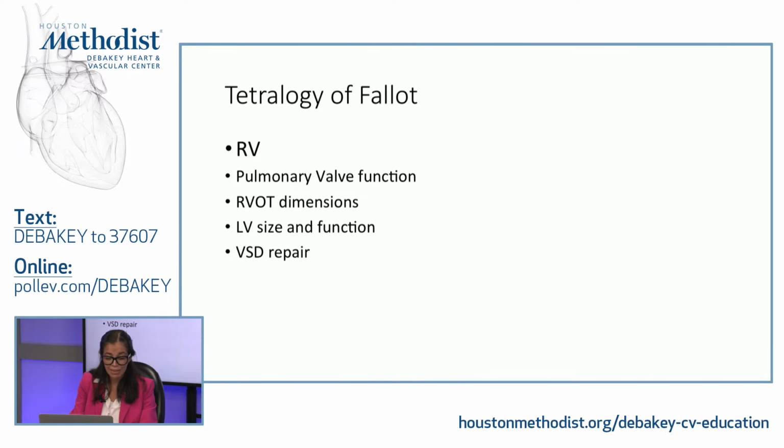And lastly, we need to assess for everything that was done. So we need to look at the VSD. And we'll see all of this in pictures now.